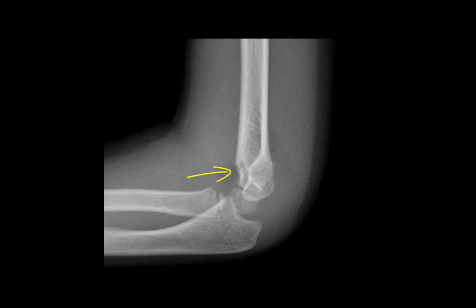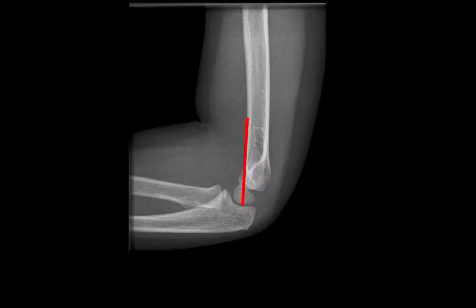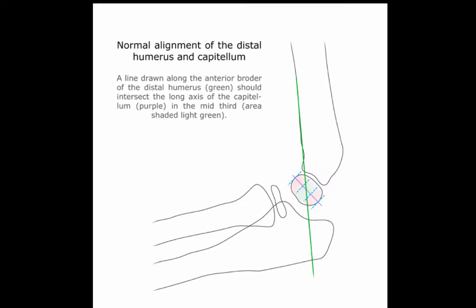Now we can see a fracture of the distal humerus in this X-ray. We also know that this is an angulated fracture because if we trace a line down the anterior aspect of that distal humerus, you can see that it goes through the anterior aspect of the capitellum, and that's abnormal. The anterior humeral line should go through the middle third of the capitellum. This may be the only sign that a fracture is present, illustrated here with the green line going through the middle third of the capitellum.